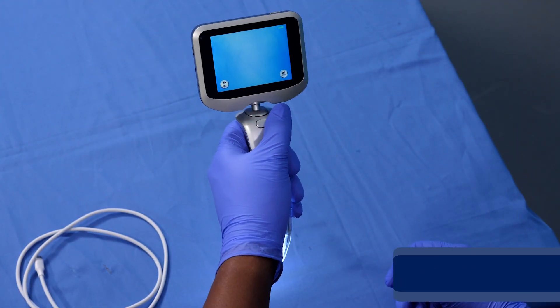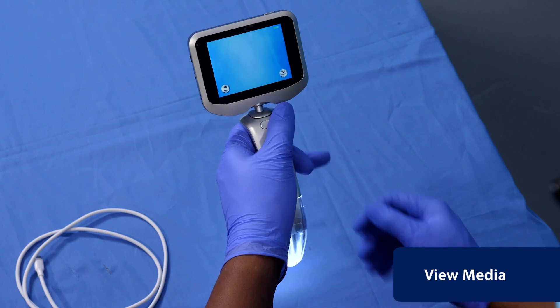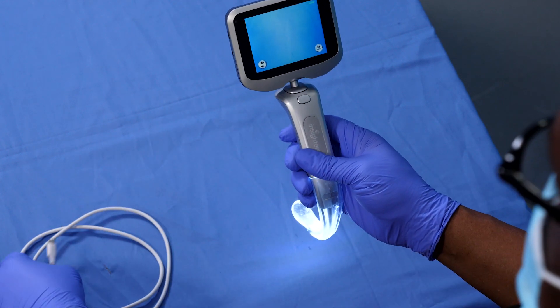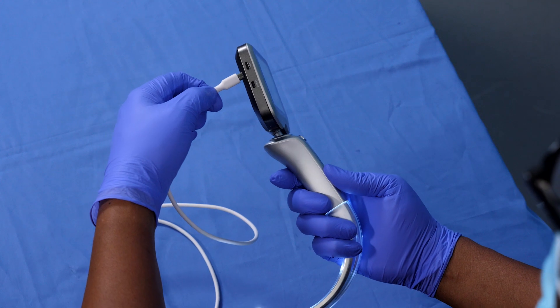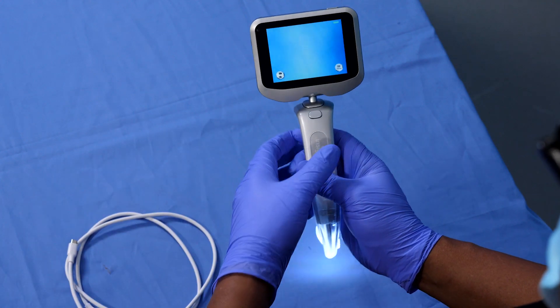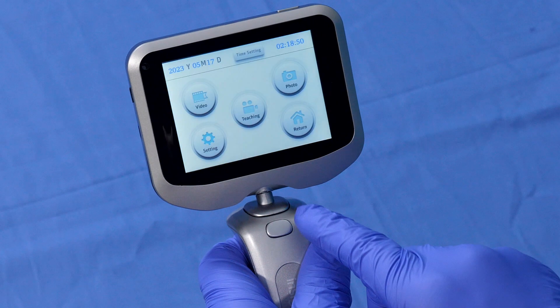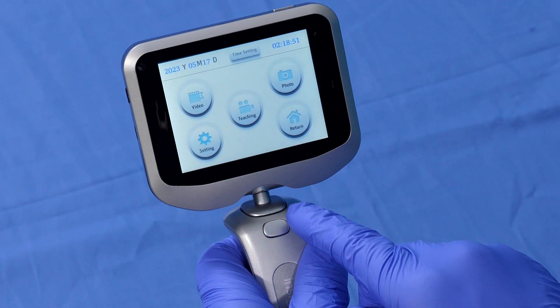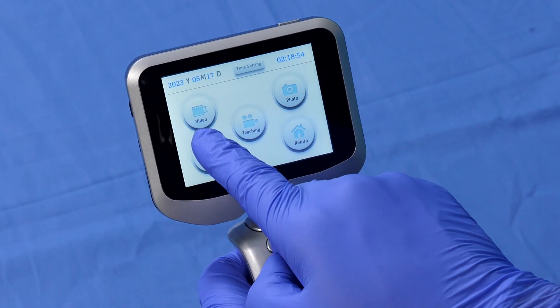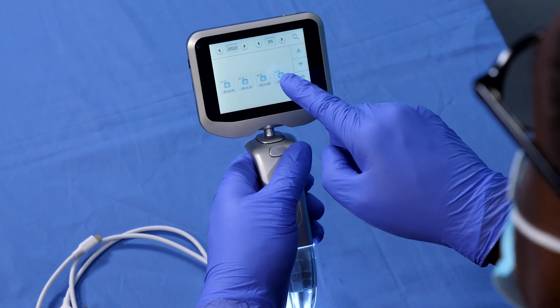To view and manage the photos and videos on the Video Laryngoscope screen or on the computer via micro USB cable, press the Inside Menu button on the screen. Press the Photo or Video button to review and delete the photos and/or videos taken.